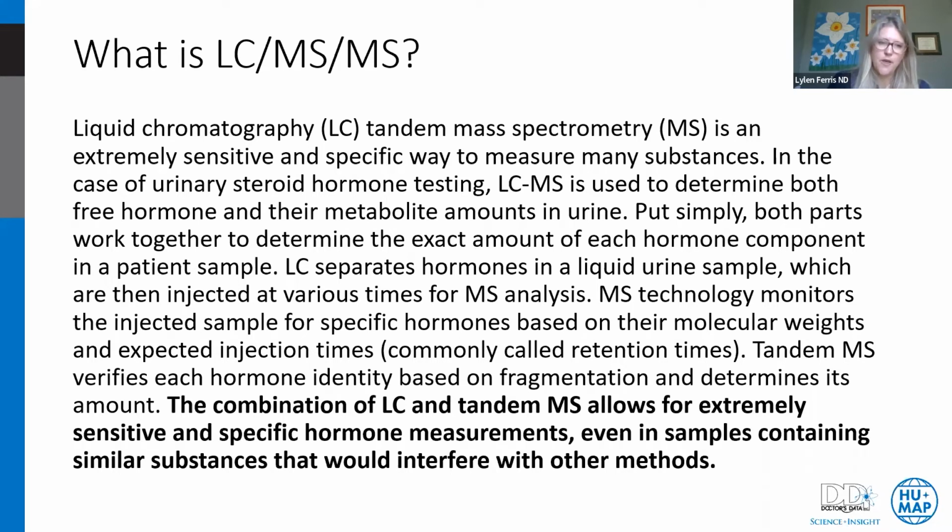So here's the bottom line if you don't speak lab speak, and I'm not fluent in it myself, but we know that the combination of LC and tandem MS allows for extremely sensitive and specific hormone measurements, even in samples containing similar substances that would interfere with other methods.